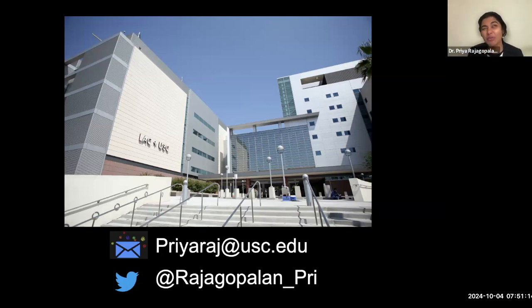So that will give you an estimate of how much expansion there is, but it won't give you the details of the actual tumor. But it can give you something as to the size of the tumor. It can tell you if there's a myelographic block, meaning the CSF is not able to pass across the tumor, so it's a big tumor. And then the definitive diagnosis is going to be through a biopsy and looking at the histopathology of it. But that's just a rough estimate of what we can make do with, with CT when we don't have MRI. But that's a great question.